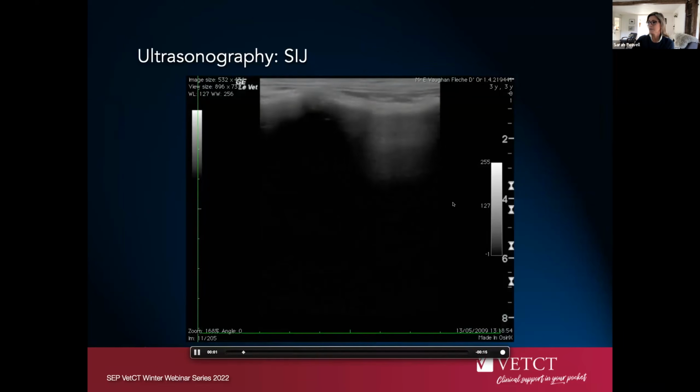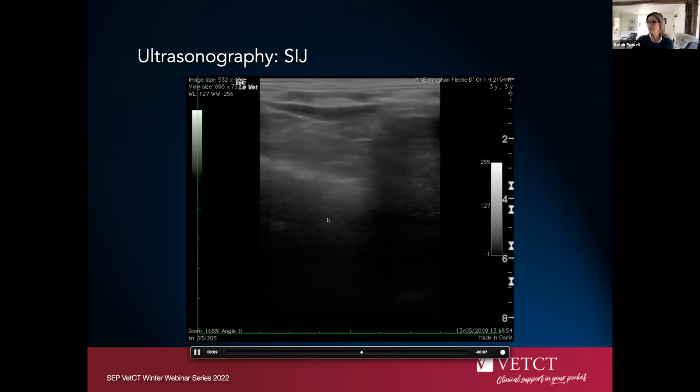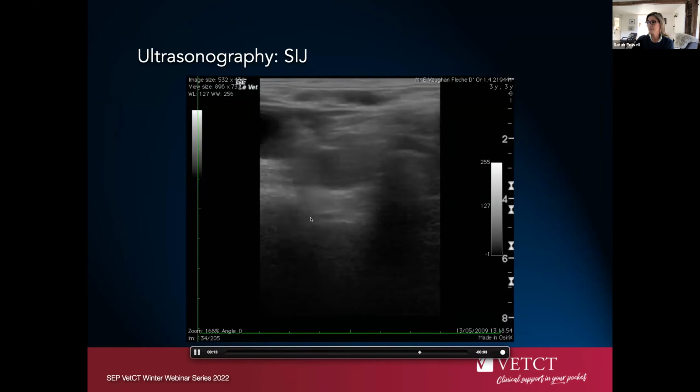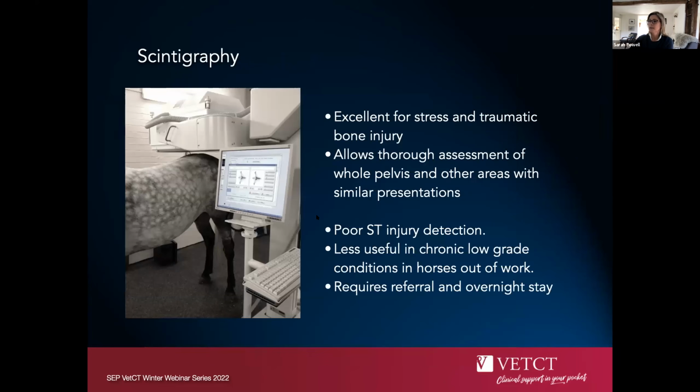So if we just go back to the video, at the disc here, we're deeper here, move back 1 space off to the side, a little bit too far back, it's here somewhere. So here's the sacroiliac joint here, relatively normal looking joint space here. So you just have to come caudally and then off to the side, and it should be there.